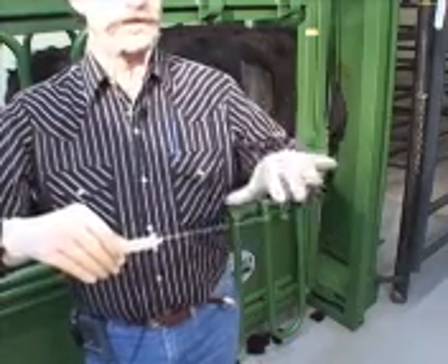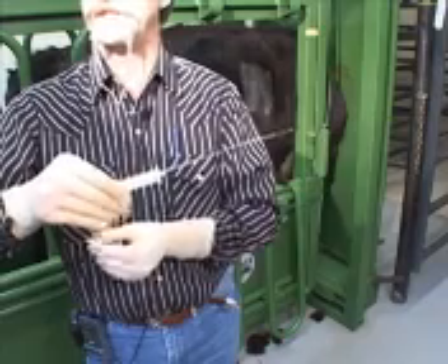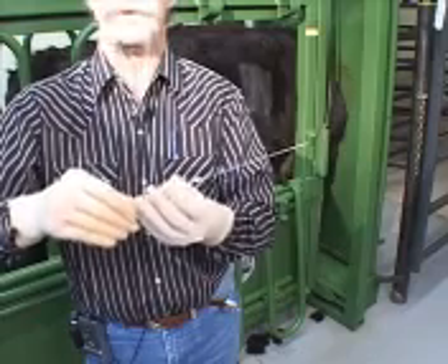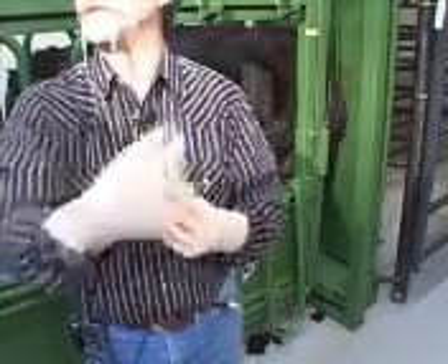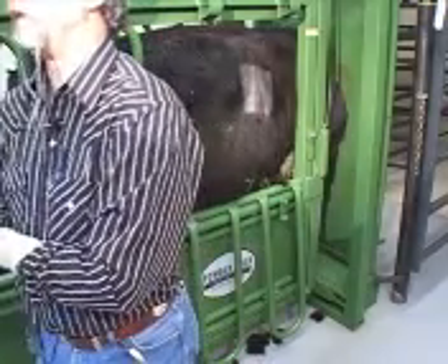I generally wiggle the needle a little bit to get the liver to kind of settle down into that notch. Then you want to hold the stylus itself solid, and you actually advance the outer sleeve by pushing it forward towards the animal. That outer sleeve has a cutting surface, so as you push it forward, it cuts the liver down into that notch. Then when you pull it out and open it up, you've got a piece of liver sitting in that notch.